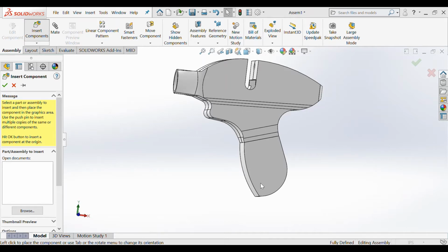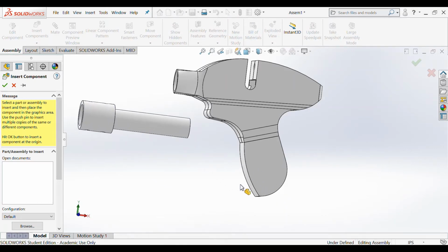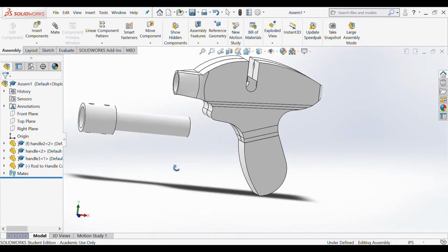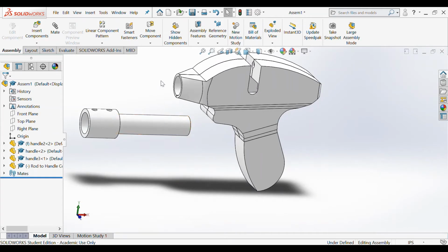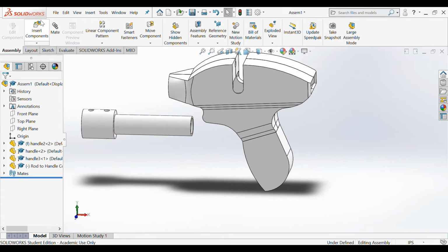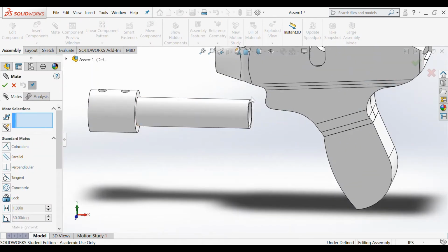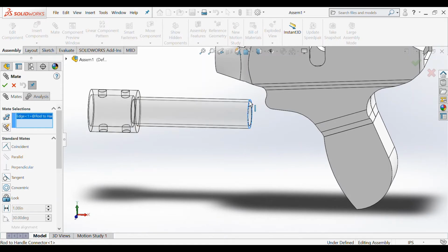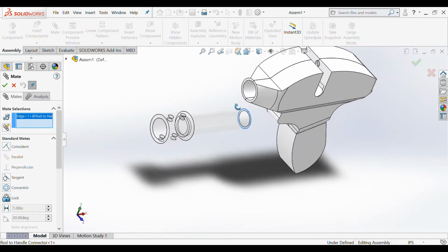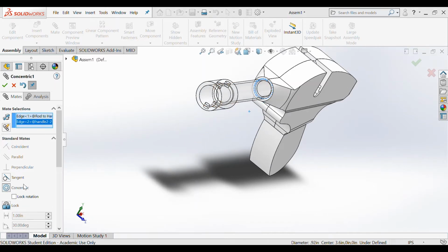Which is the rod to handle connector. We're going to go on ahead and click. So this piece right here is inserted into the handle. So what we're going to want to do is we're going to do a concentric mate. We're going to click on the outer circle of the tube and on the inner circle right there, and we're going to make sure it's concentric.